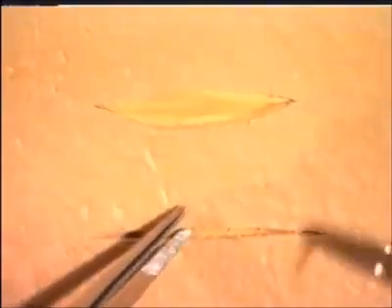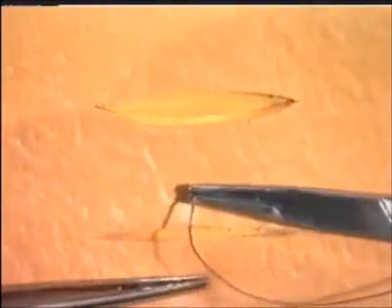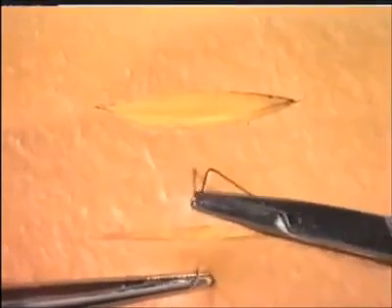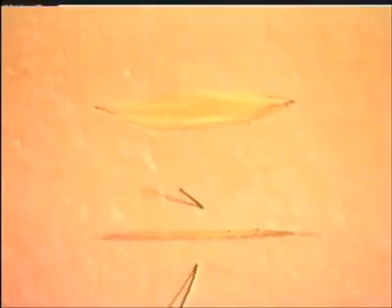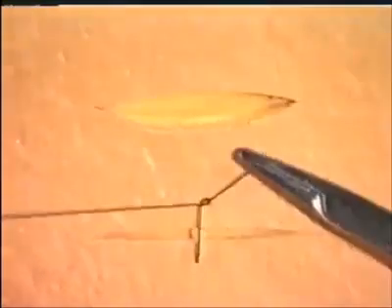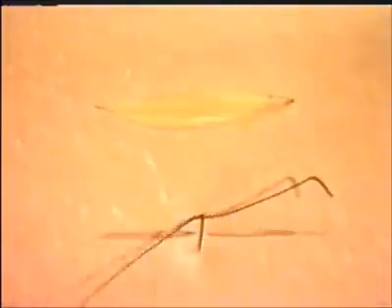When closing a linear wound, it may be easier to start in the middle of the wound, as you see here, inserting an interrupted suture, and then ligating it. Remember, with these simulated pads, the tissue is often very springy, more so than normal skin. Make allowance for this during your exercises.